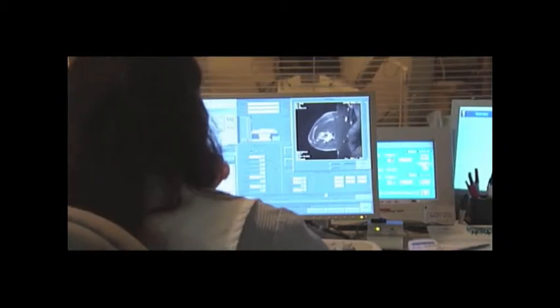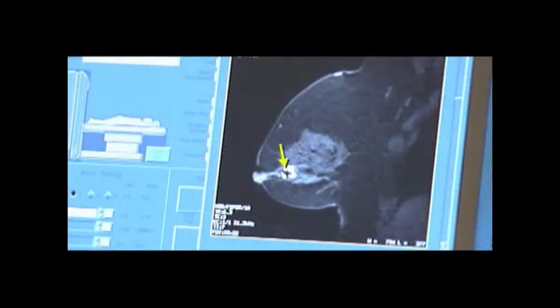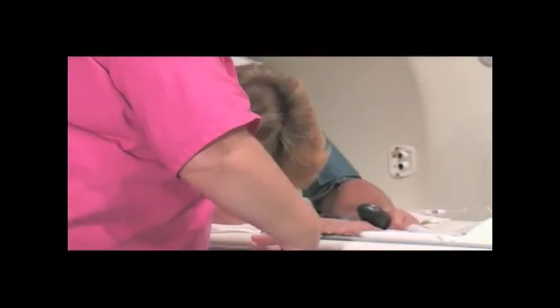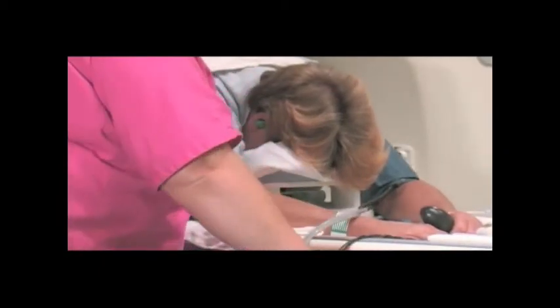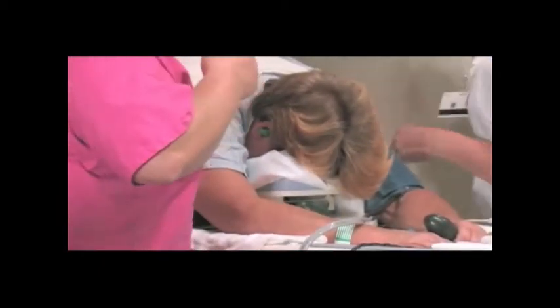Acquire images in the sagittal and axial views to verify target accuracy. The localizing obturator will project as a signal void, appearing as a black dot on the sagittal image and as a black line on the axial image. Once the target has been confirmed, shuttle the patient out of the magnet bore and proceed with the biopsy.